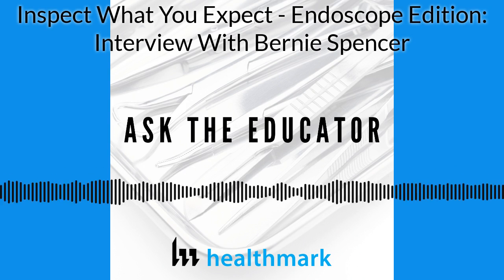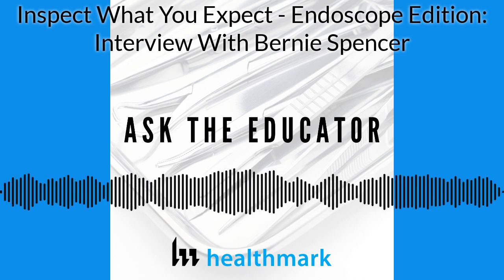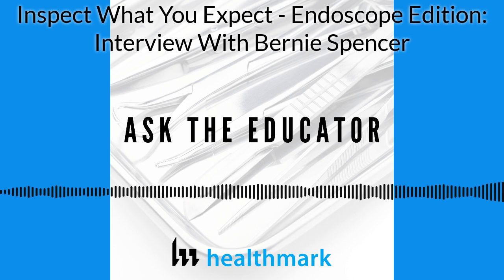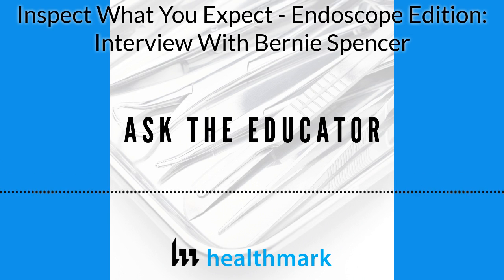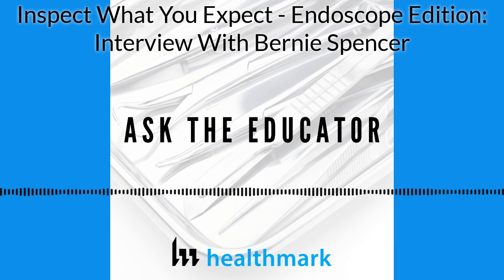In my opinion, I now know what to do so that I can obtain a better outcome, a scope channel that's been cleaned to an acceptable level before high-level disinfection. And finally, I went from a position of not knowing if the channel was adequately cleaned after brushing to, after reading the literature, knowing that it has been adequately cleaned. There was testing available that I didn't know about, and I didn't know that I didn't know. It was only by reading information outside of our facility and keeping informed about current technology that I was able to improve our process, resulting in higher quality patient care.